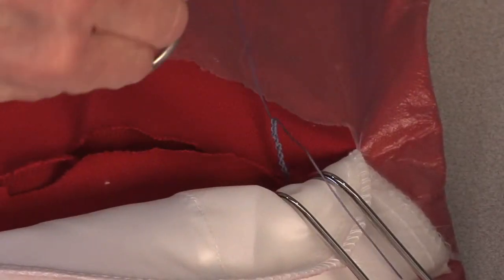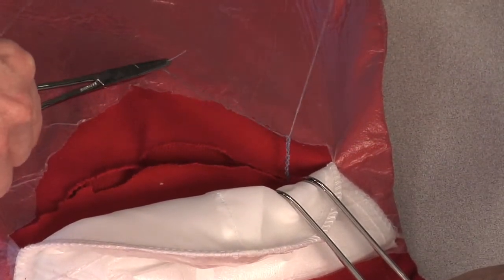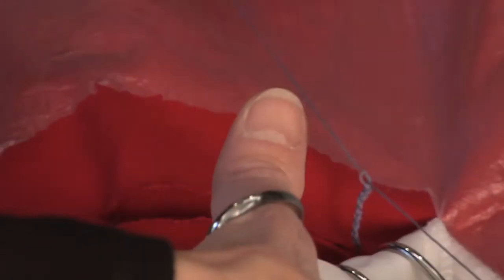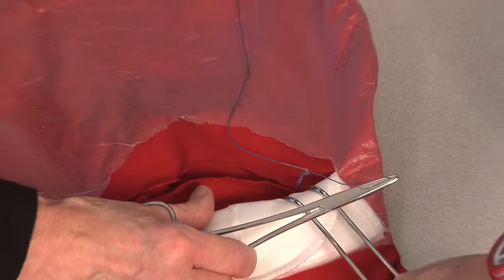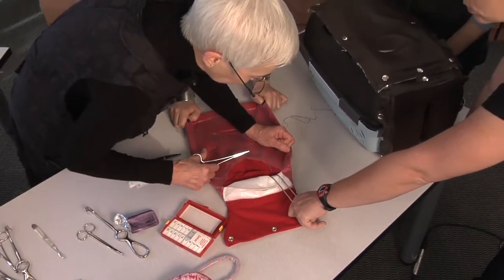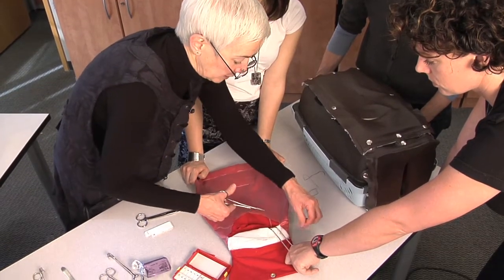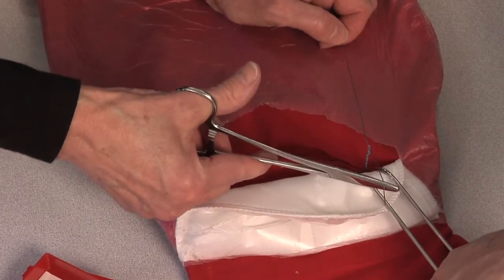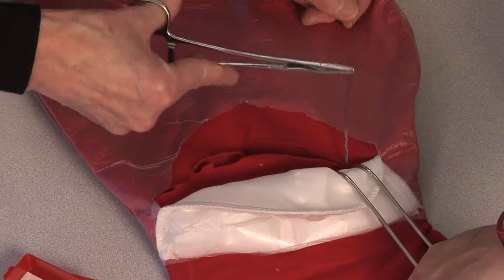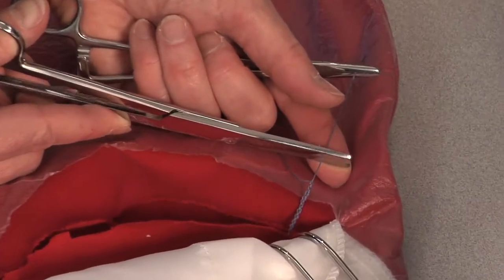Another knot we practice is called an instrument tie. You make the loop and pull it through — make the loop and pull it through. When we practice knot tying we use shoelaces because they're really big, so you can really see the knot. You'd have to look carefully to distinguish a granny knot from a proper surgeon's reef knot. African students are often good at the instrument tie because you waste less suture that way. We start with the two-handed knot, then the one-handed knot, then the instrument tie last.